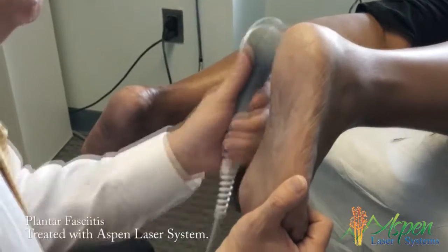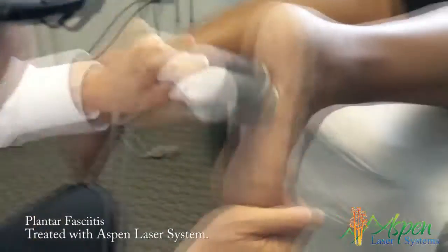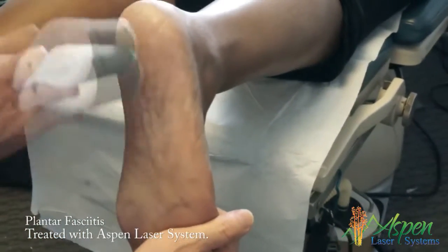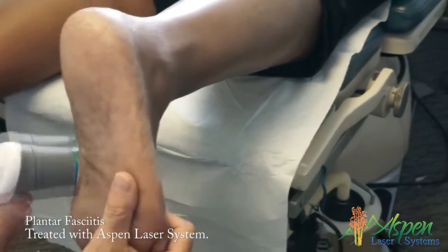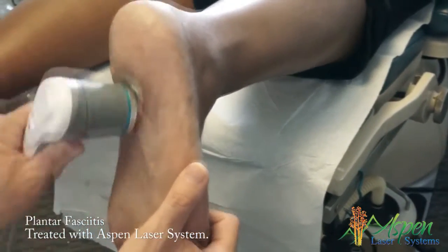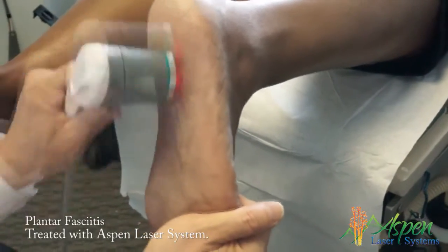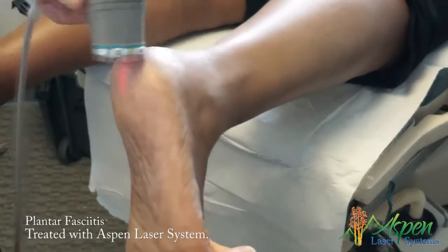I'm pulling your toes back. How bad is your plantar fascia where I'm working — has that hurt a lot down in here? I would say that's a five. When you move, is the pain here, here, or everywhere? It's more the heel in the back, where you were concentrated before.